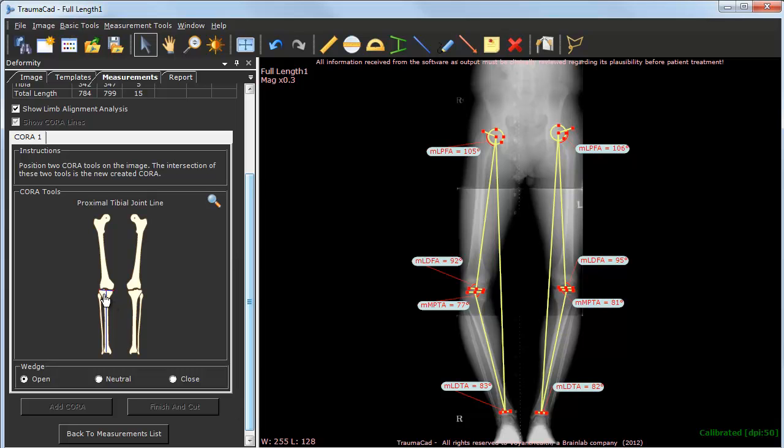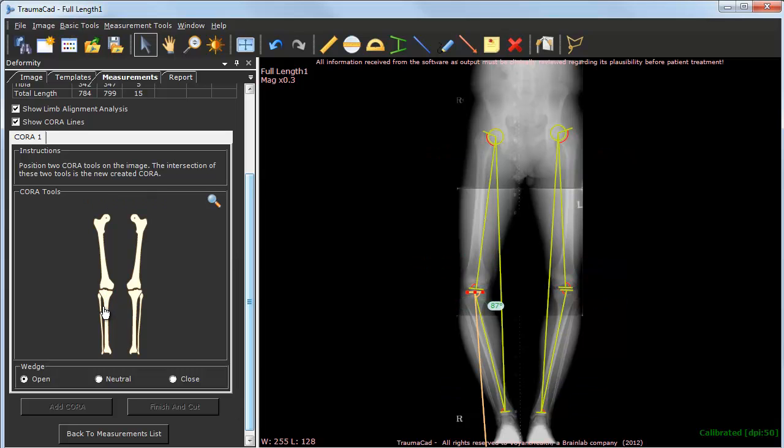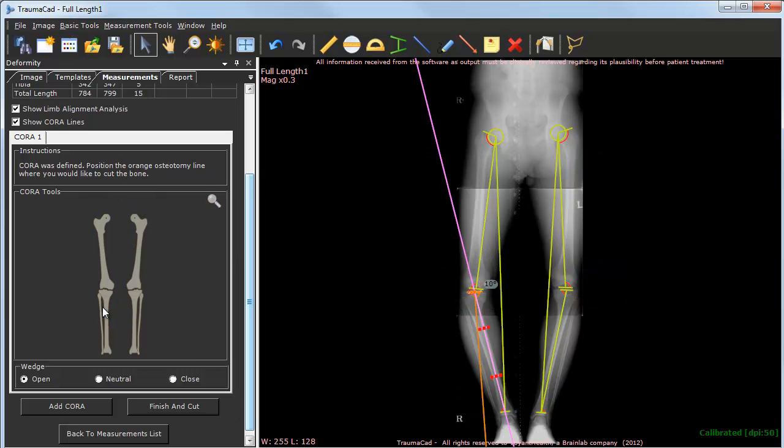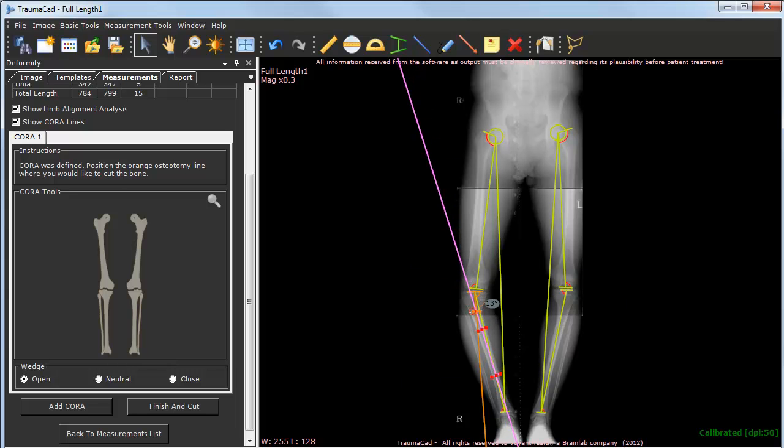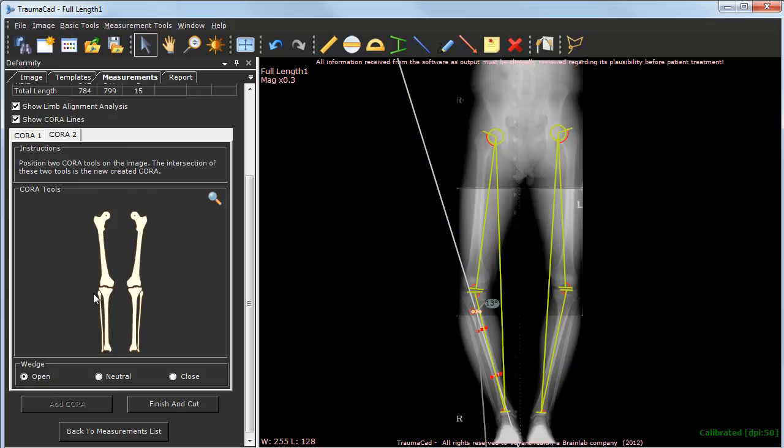Next, I'd like to find the CORA—Center of Rotation Angulation—by selecting two axis lines from the skeletal mesh. Up to four CORAs can be created per image. Once completed, a simulation of osteotomies and implant selection can be done.